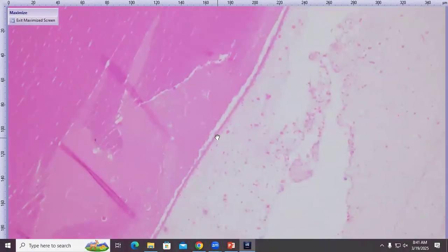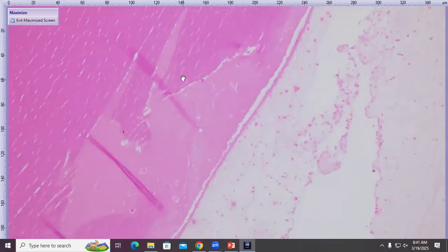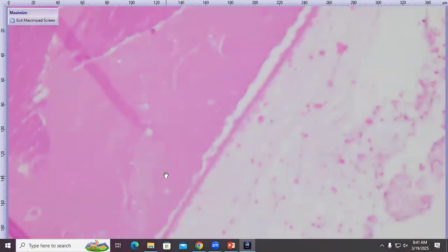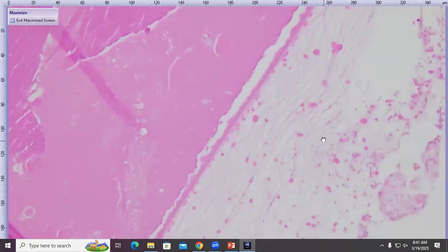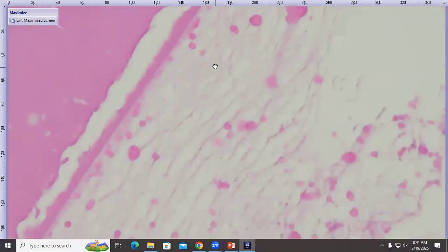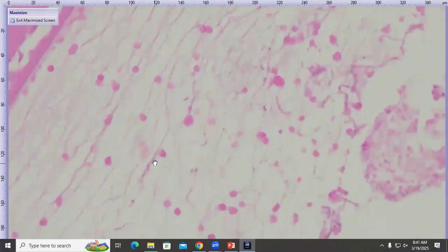Looking at our lens. You can see some of our nice intact lens fibers, and then we lose that nice discreteness to them, and they become liquefied. We start to see some rounding up, so some more Morgagnian globules. Again, features of cataract degeneration. And then outside of the lens capsule here, that was mainly intact, we have these eosinophilic globules of lens protein. And so again, that could be part of what the macrophages were gobbling up in that carpet.